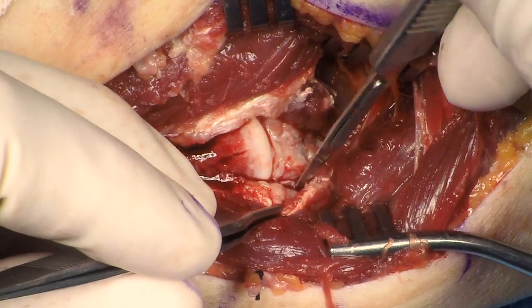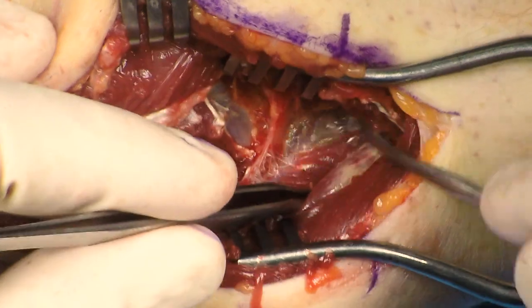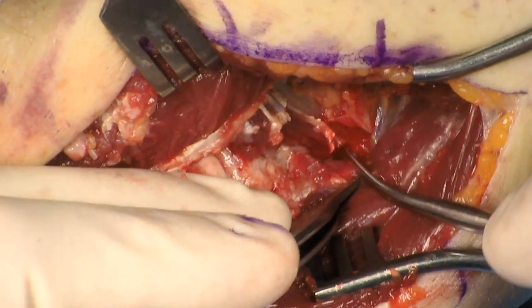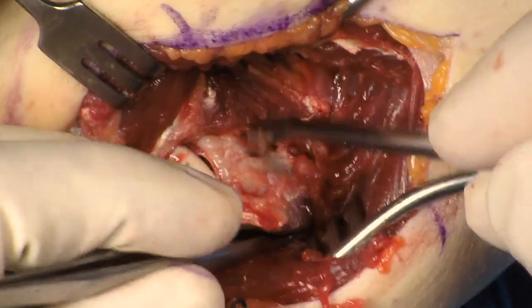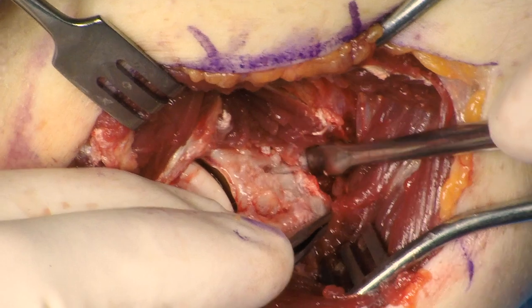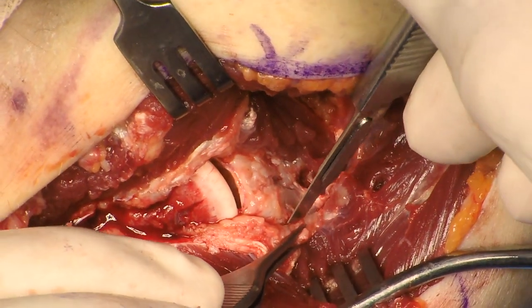The dissection is then taken posteriorly. A portion of the MCL can be elevated but does not need to be elevated — the plate can be placed on the MCL. Subperiosteal dissection is then performed on the ulna as well as on the fracture. Dissection is taken distally for plate placement.